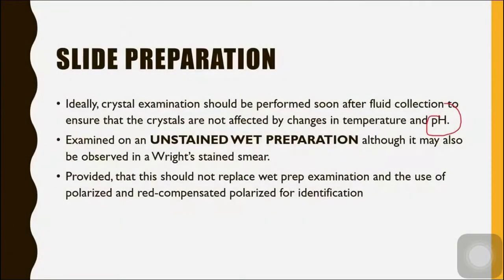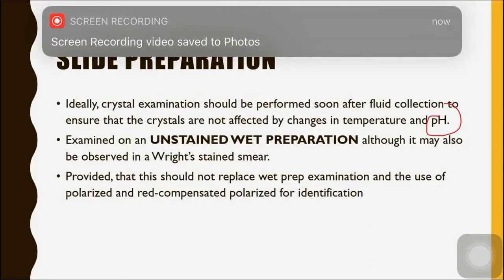After fluid collection, ensure that the crystals are not affected by changes in temperature and pH. Earlier, we discussed that in specimen collection, the anticoagulants used should not be powdered because they may precipitate crystals and interfere with the crystal analysis. Specimens should also not be refrigerated prior to examination, again because it may interfere with crystal analysis and identification.